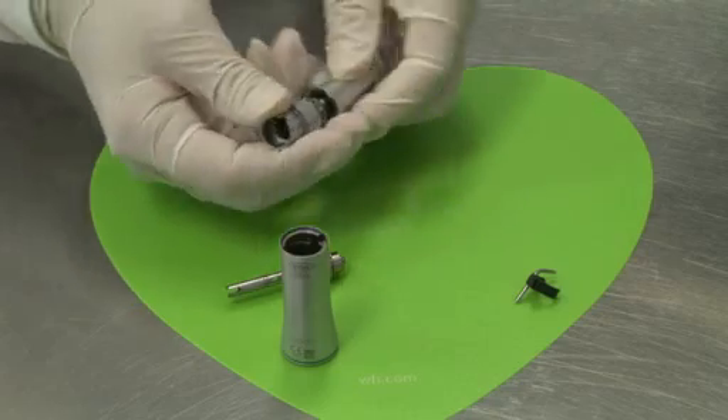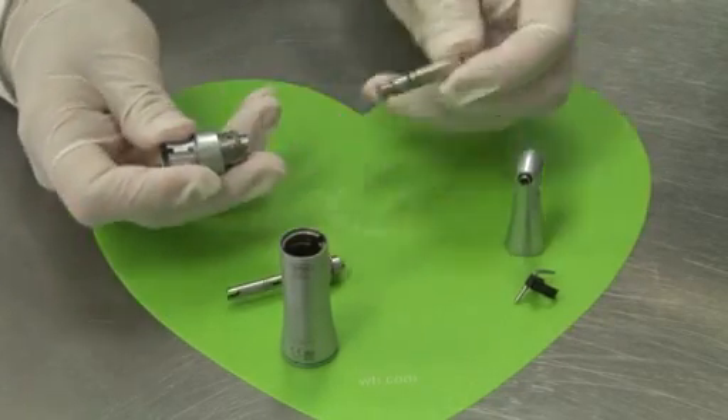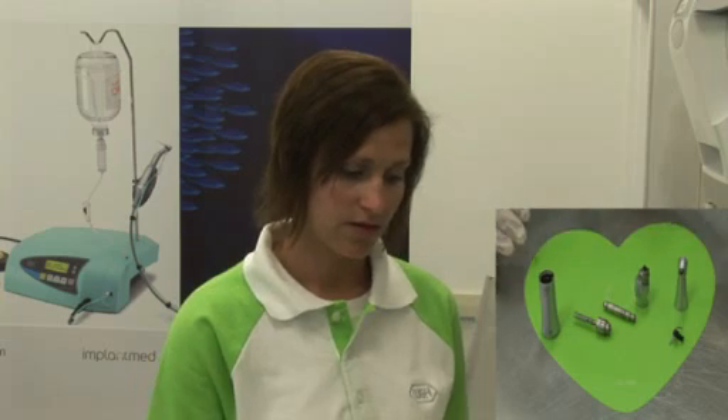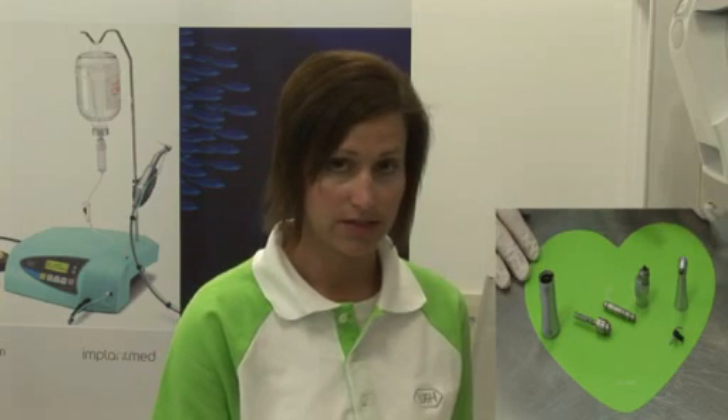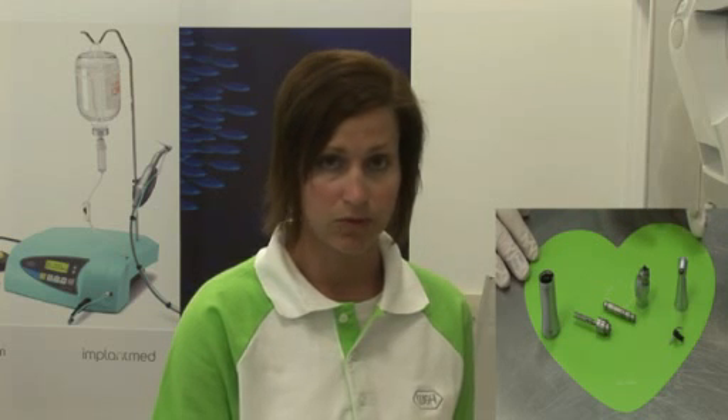Pull the head gear, middle gear assembly, and lastly you have the knee. These six components can be individually cleaned accordingly to remove biomaterial such as blood, saliva, etc.